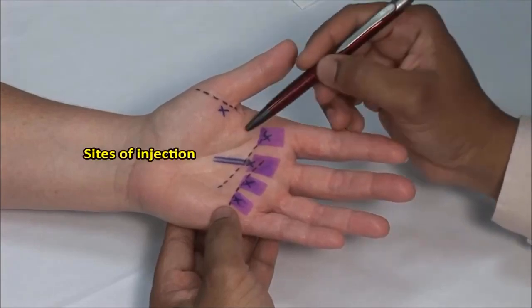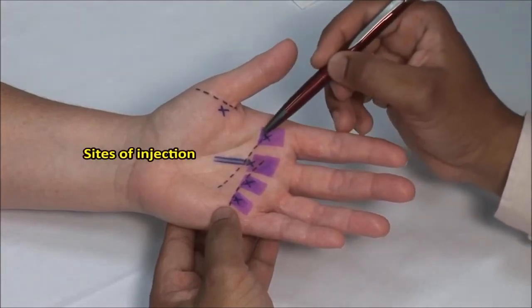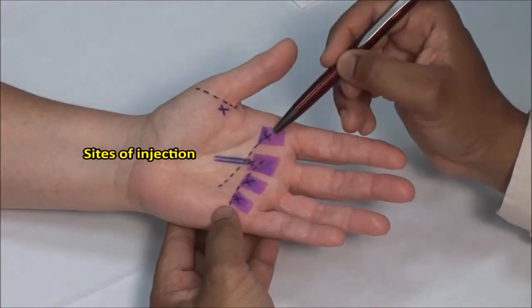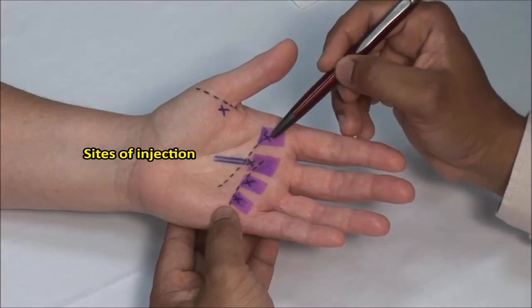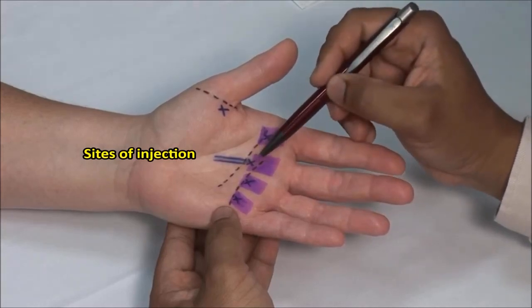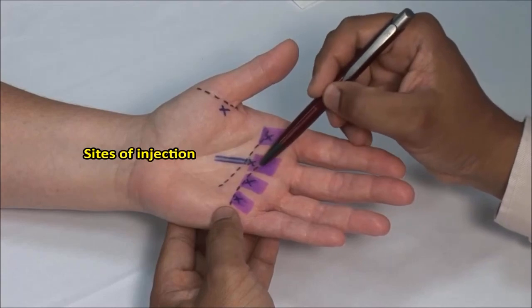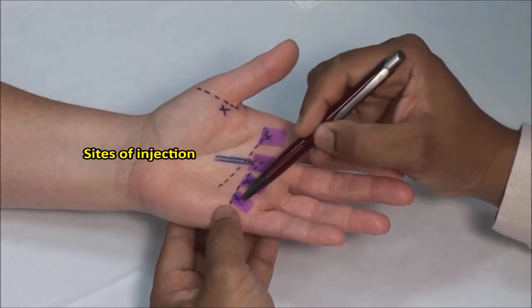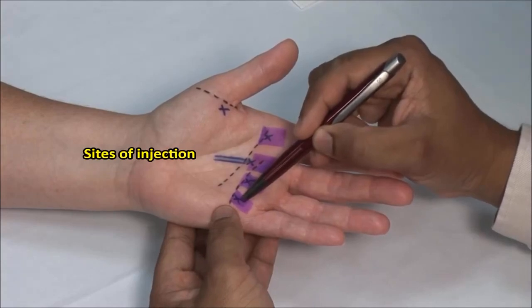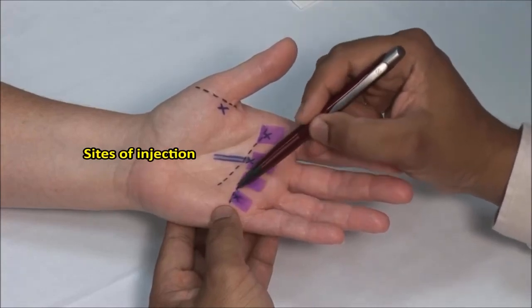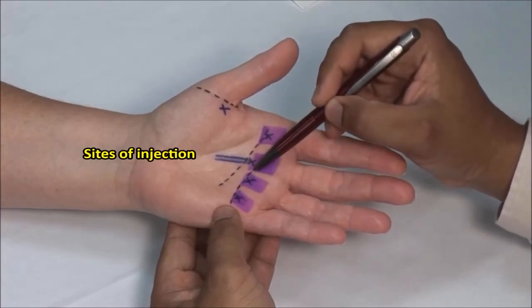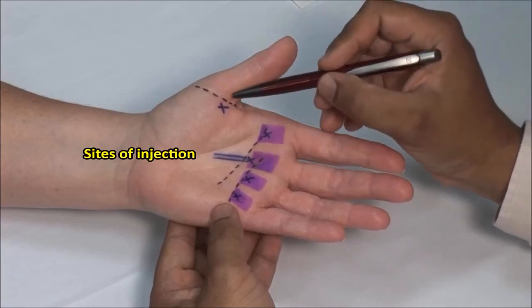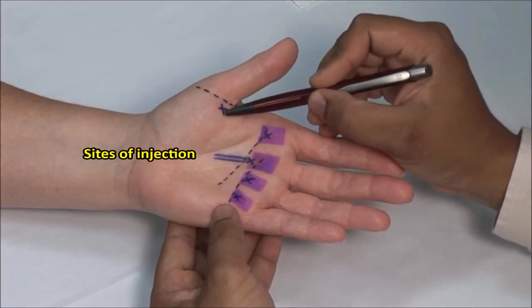The point for injection of the second flexor is just distal to the proximal transverse crease. For the third flexor it's halfway between the proximal and distal transverse creases, and for the fourth and fifth flexor tendons it is about one centimeter distal to the distal transverse crease. For the thumb flexor it's just proximal to the thumb MCP crease.